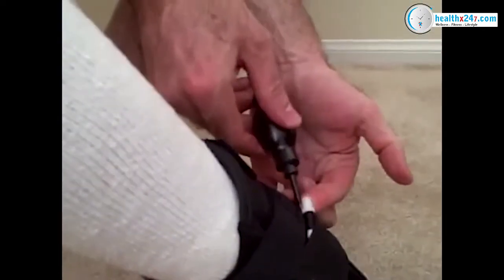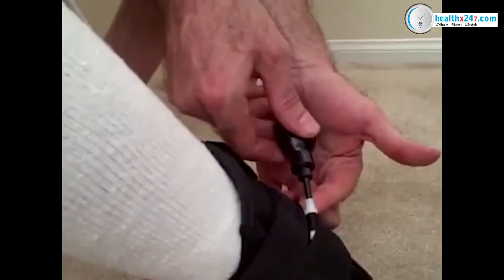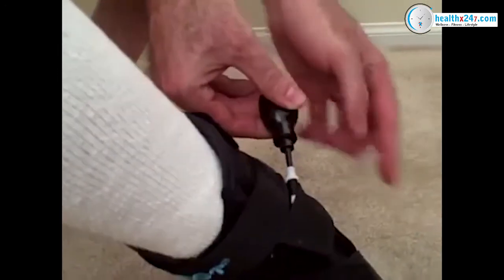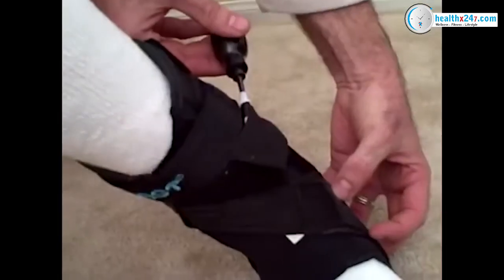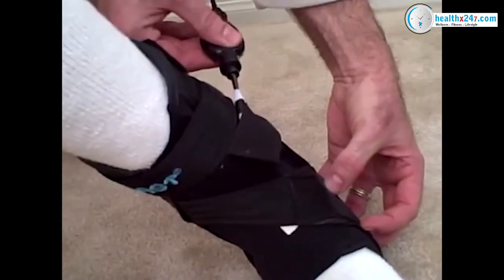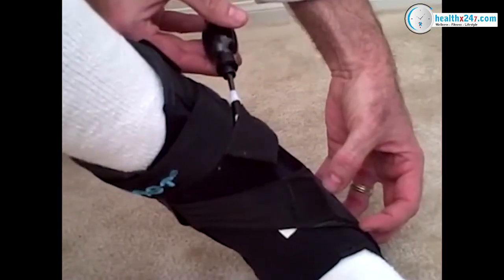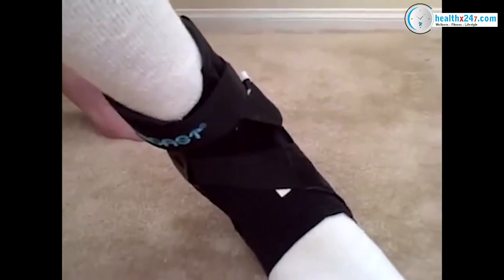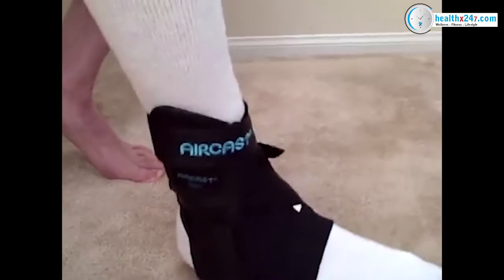I'm going to take my air pump, put it in here and squeeze it, which is inflating the bulb located underneath the arch area and is going to boost up my arch height. I can walk around in this brace for hours before needing to adjust the bladder underneath the arch area.